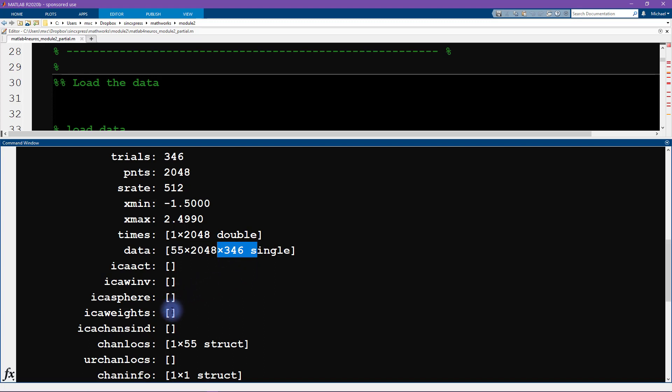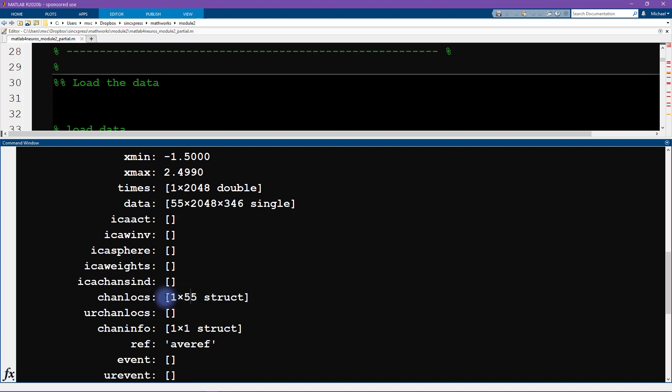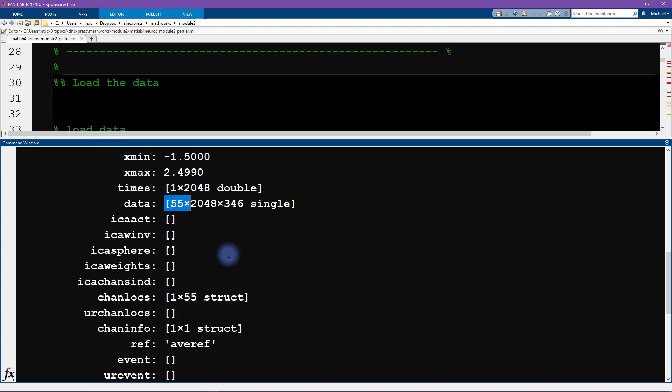Another field in this structure that we will be using quite a bit here is called chanlocs. Locs stands for channel locations. And you can see that this is itself also a structure. It's an array of structures. So there's 55 of these structures. It's a structure embedded inside another structure. And of course, 55 corresponds to the number of channels.